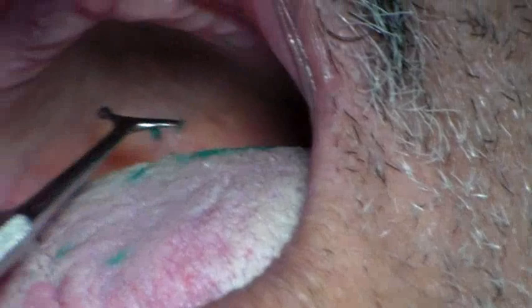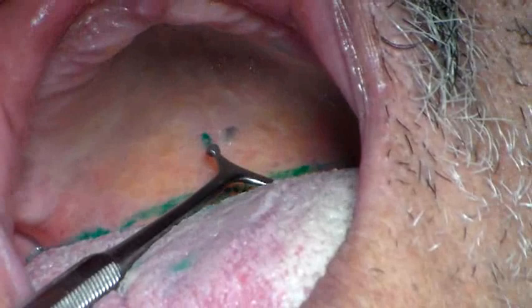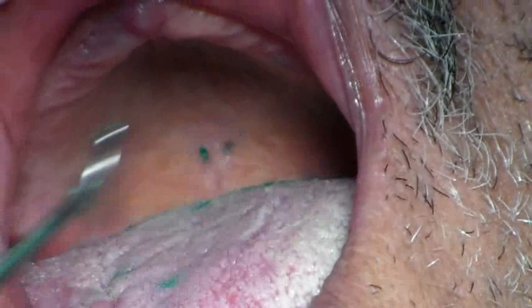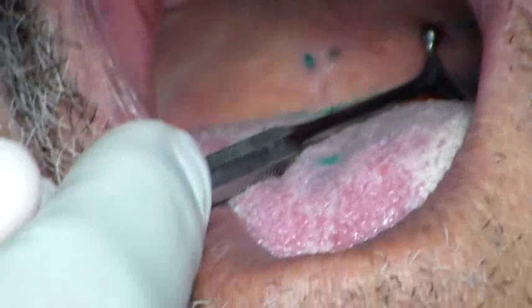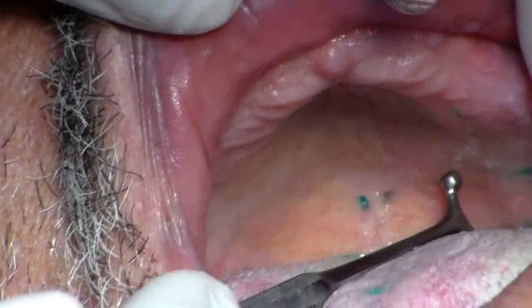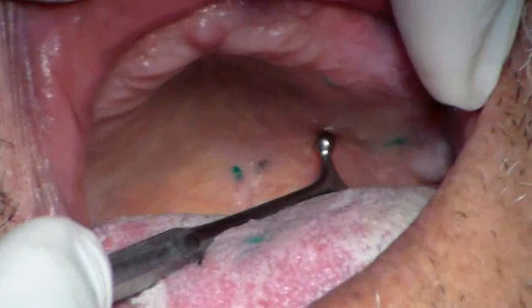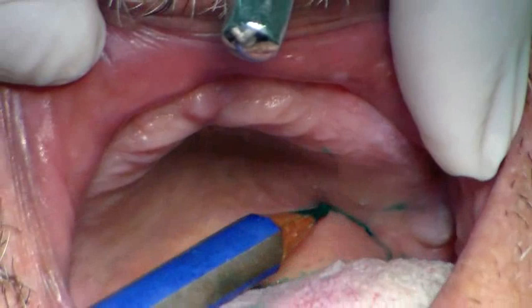In the center we have the mid-palatal raphe, which is a relief area, coming down to the fovea palatini. Once you reach the fovea, you know you are draining into the soft palate region. From the midline, using the ball end, if you compress to the side, you will see that there is a compressible area. Moving anteriorly, you find that the compressibility stops. So there is an area that is compressible, beyond which it gets difficult to compress.